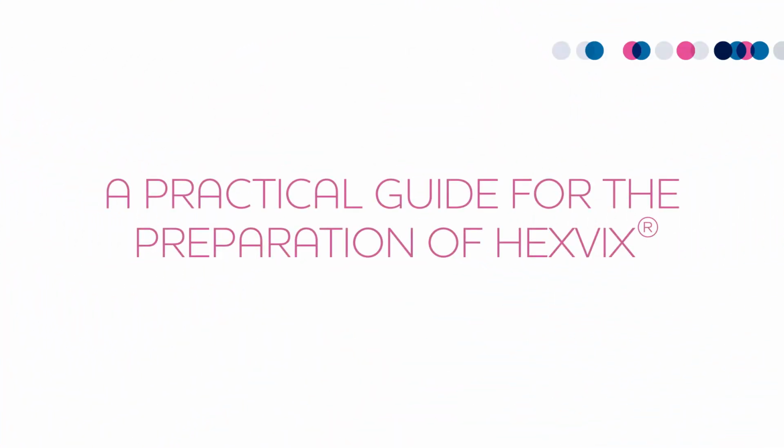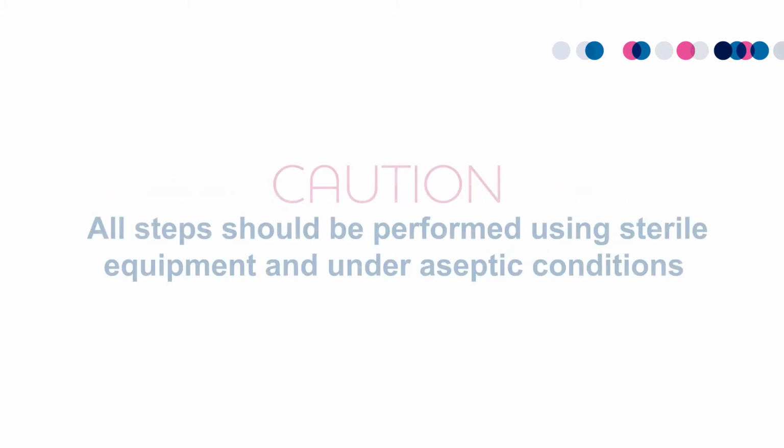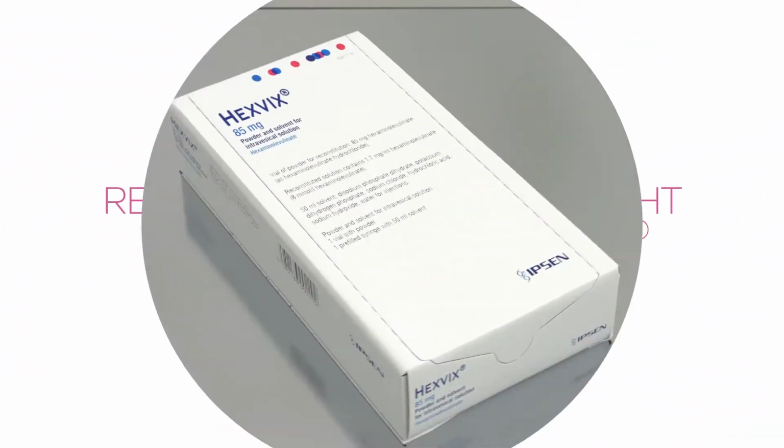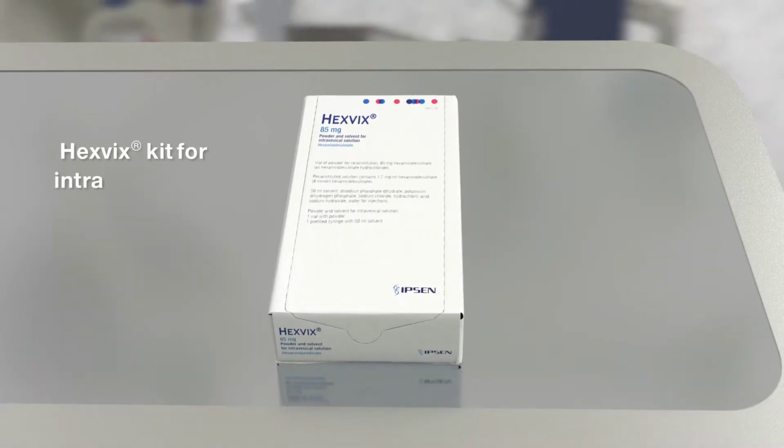Welcome to the step-by-step handling guide for the reconstitution and installation of Hexvix. For reconstitution and installation, you will require one Hexvix pack.